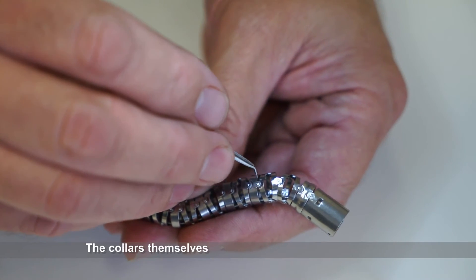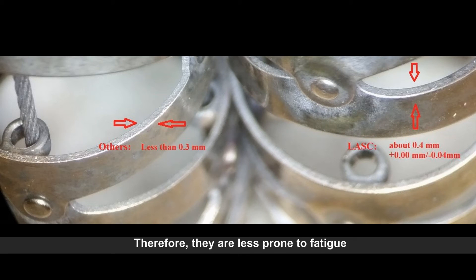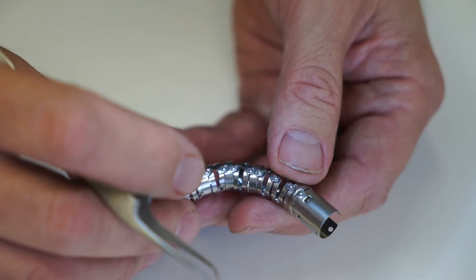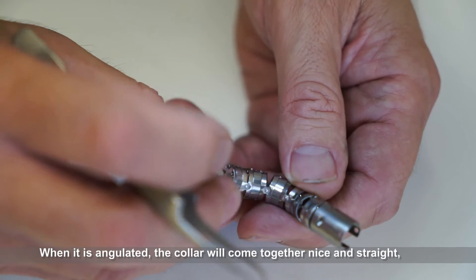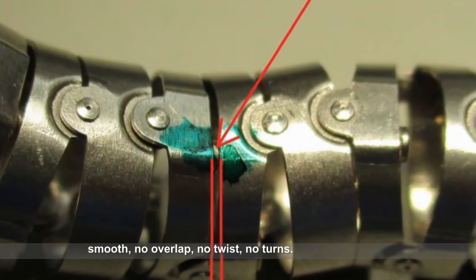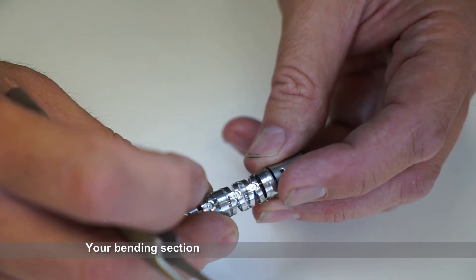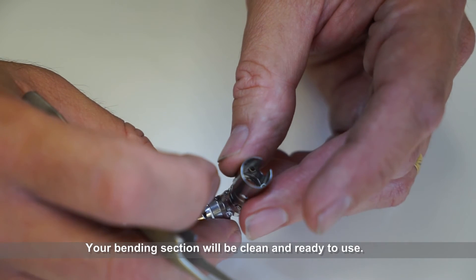The collars themselves will be nice and sturdy. These in particular are slightly oversized and therefore are less prone to fatigue. When it's angulated, the collars will come together nice and straight and smooth — no overlap, no twists, no turns. Your bending section will be clean and ready to use.